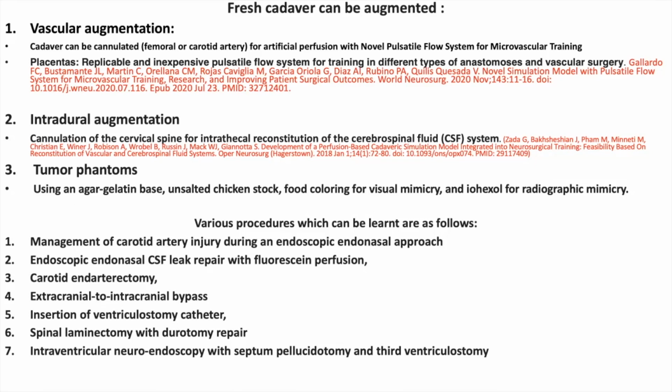Various procedures which can be learned using these augmented cadavers are management of the carotid artery injury, endoscopic endonasal CSF leak repair, carotid endarterectomy, extracranial to intracranial bypass, insertion of ventriculostomy catheter, spinal laminectomy with dural repair, intraventricular neuroendoscopy with septum pellucidum perforation, and third ventriculostomy.